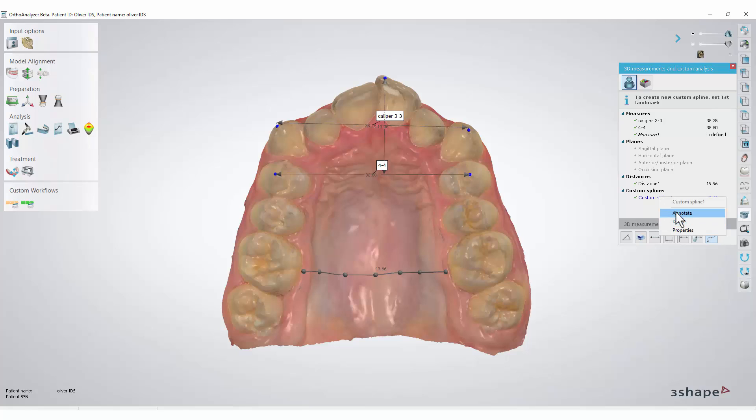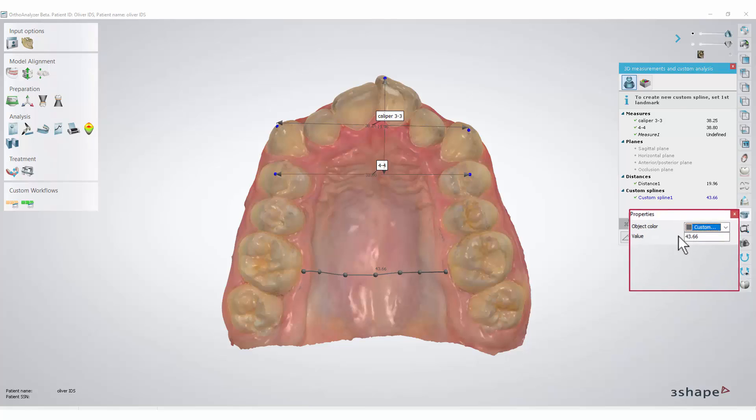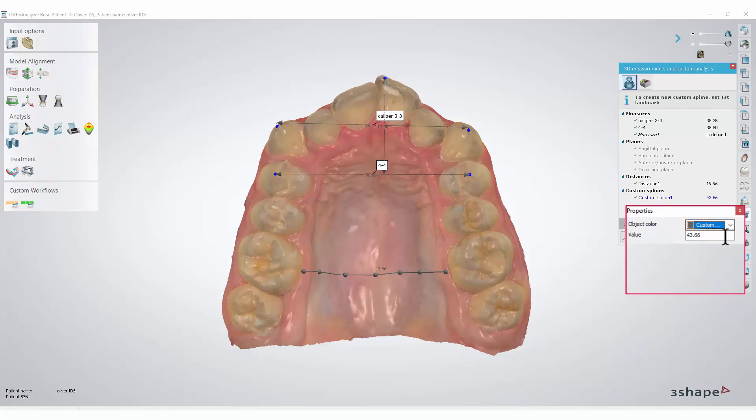As previously, we can give it another name or delete it. We are even able to give it another colour if we wish.